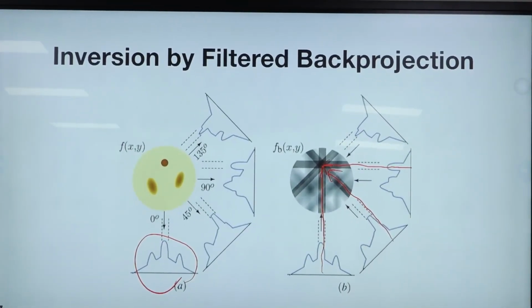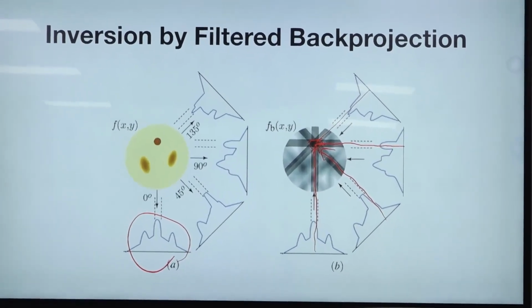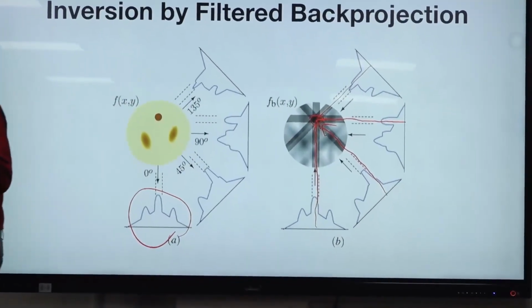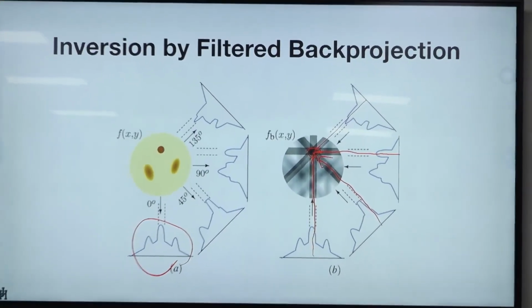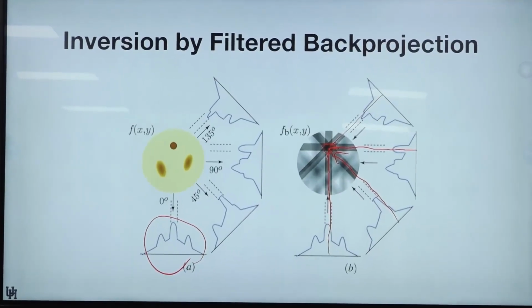Wherever these projections intersect, you can figure out the value of the absorbance of that object at that particular location. Okay.